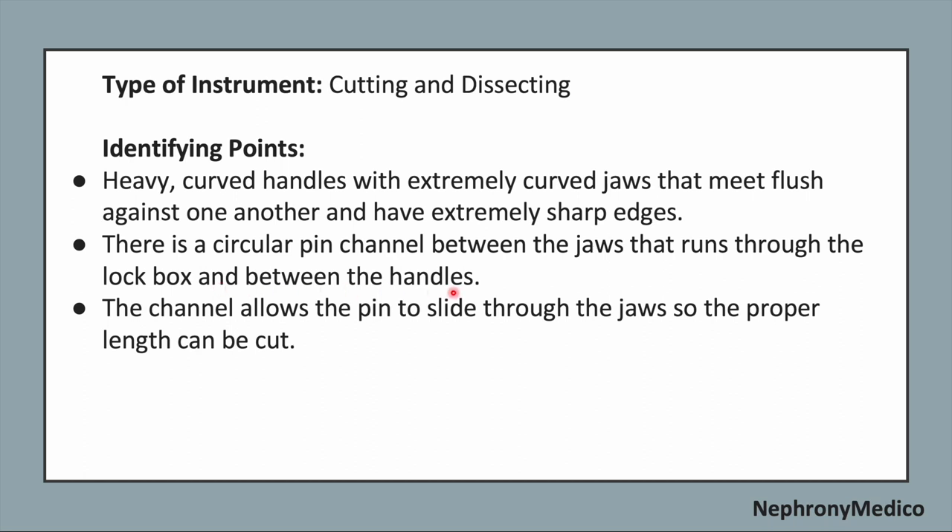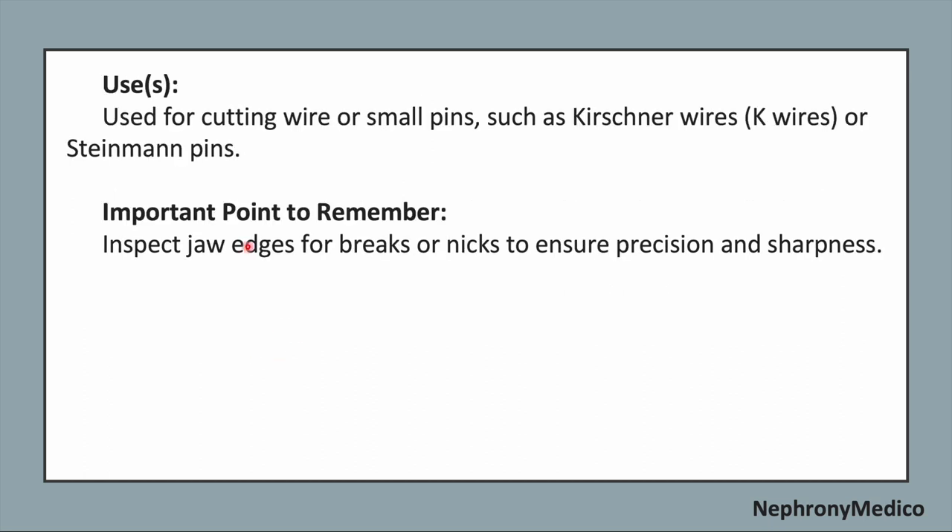The channel runs through the lockbox and between the handles. The channel allows the pin to slide through the jaws so the proper length can be cut. It is used for cutting wire or small pins such as Kirschner wire, K-wires, or Steinmann pins.